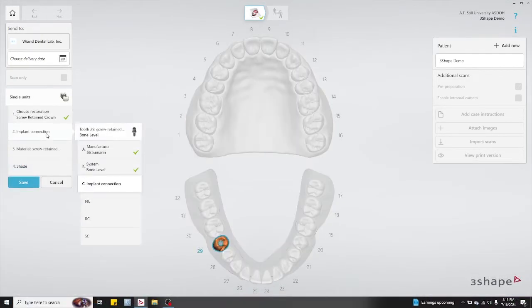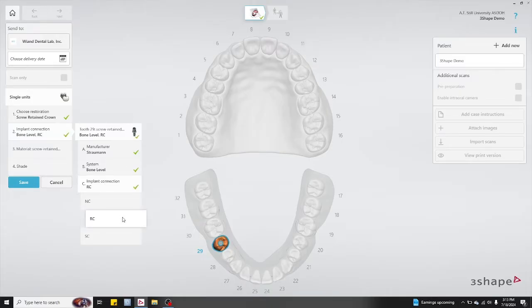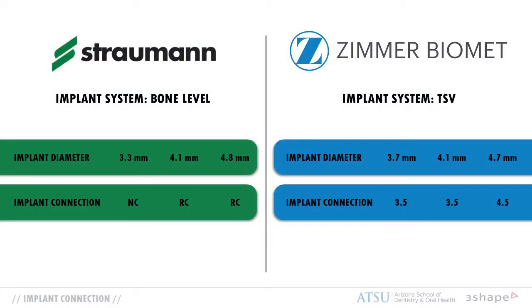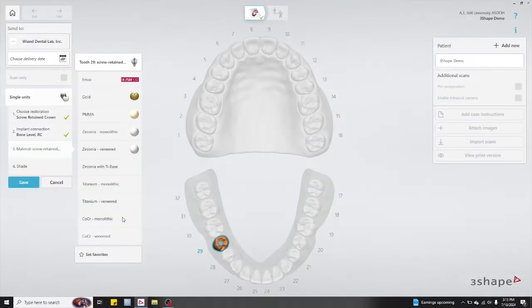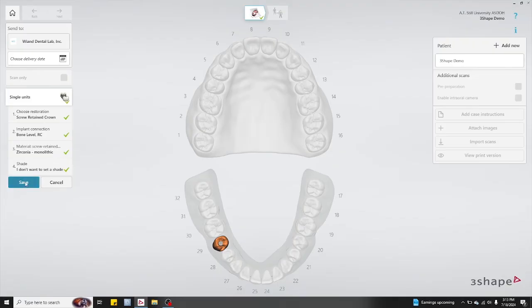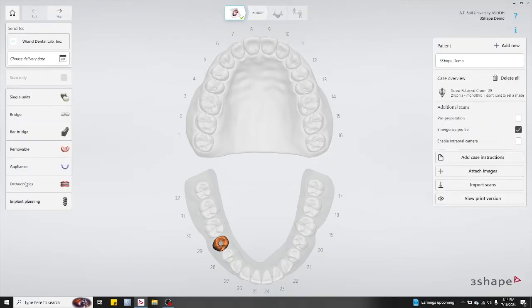The next thing to do is to input the implant details. Go ahead and choose the appropriate manufacturer system and connection — you can pause the video here and look at the chart to see which settings you need to input. For the material section, go ahead and select zirconia monolithic. The last thing you're going to do is select 'I don't want to set a shade,' which you'll fill out later when you submit your DDX lab prescription form.